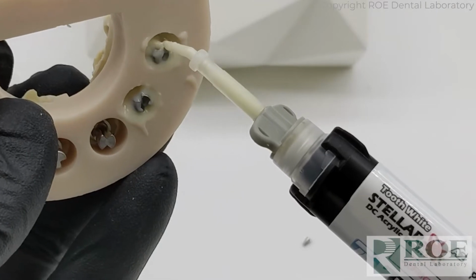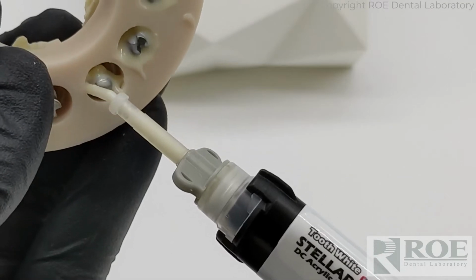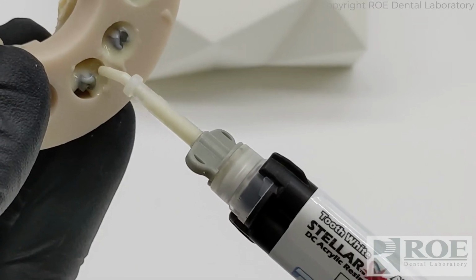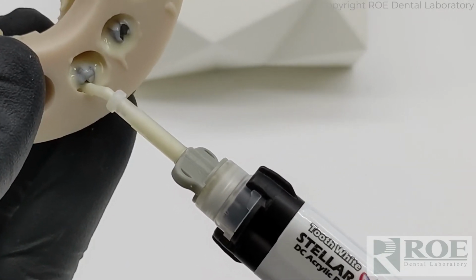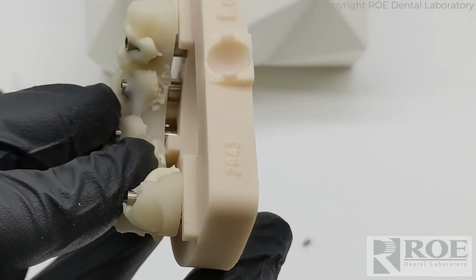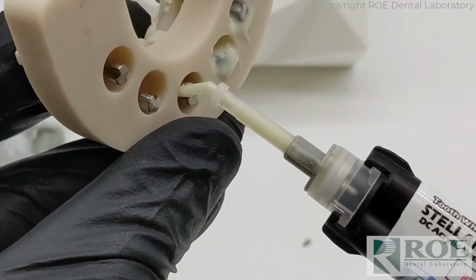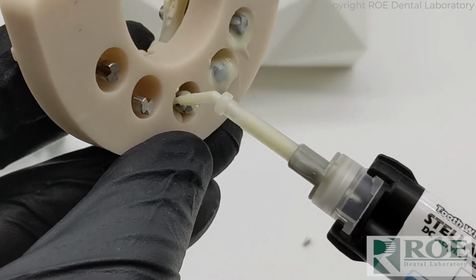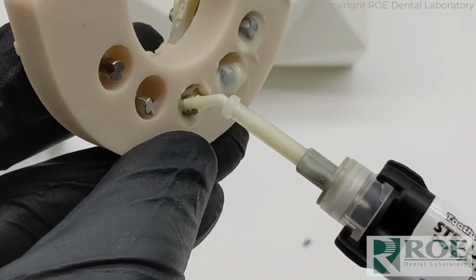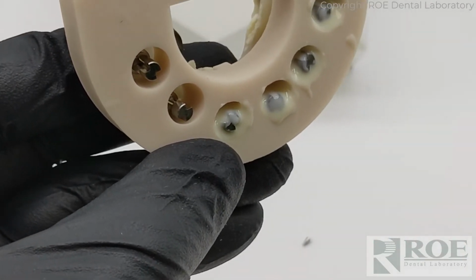Now the nice thing about these analogs is they have a very nice notch in them for undercut. So they really should be very securely fastened inside the model just based on that mechanical retention. You see how I'm not putting the tip too far down inside the model, because again, you don't want any material bonding that prosthetic to the model. So just put the tip about halfway in and then just keep it close to the surface. Okay, backfill them, and I'll be right back when it's finished.